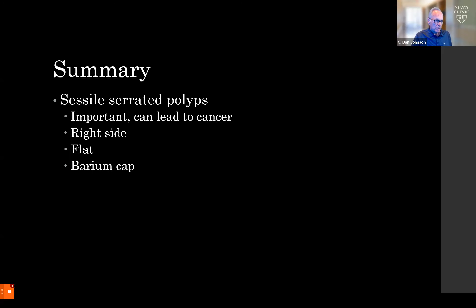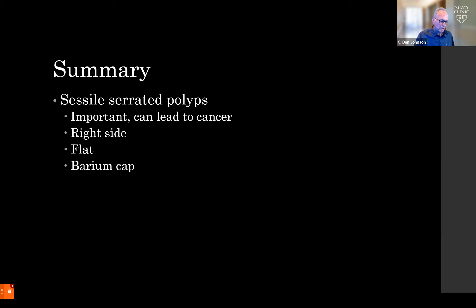In summary, sessile serrated polyps are important. They can lead to colon cancer. They're usually seen on the right side and are more difficult to detect because of their flat nature. As radiologists, it's helpful to look for that barium cap that adheres to the mucin surface of these lesions. Take a second look at the right side of the colon, look for flat lesions, and if you see barium, be sure to look deep to that barium to see if there's an underlying polyp.